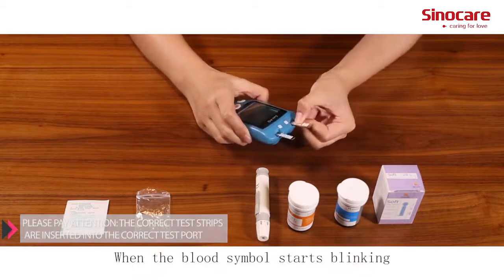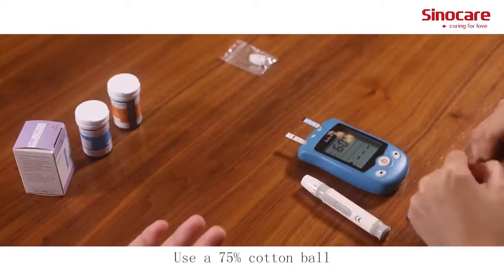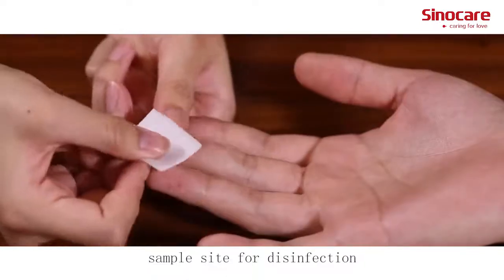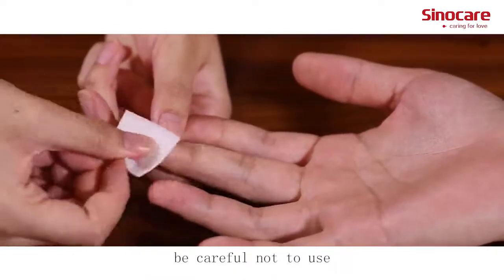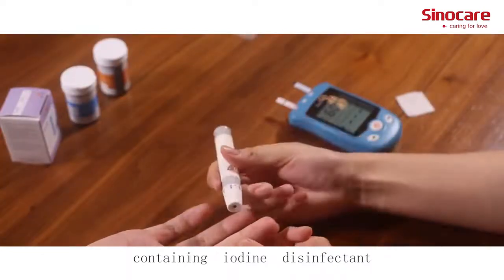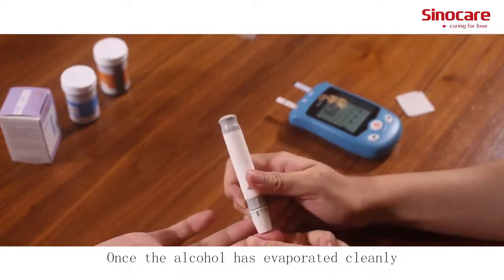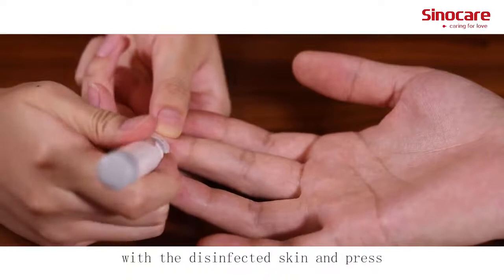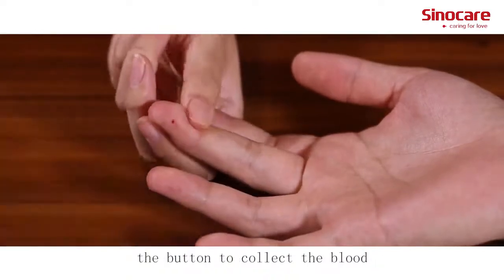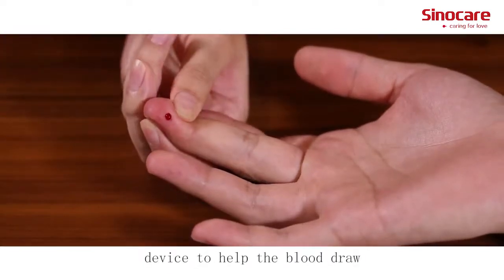When the blood symbol starts blinking, the meter is ready to use. Use a 75% alcohol swab at the blood sample site for disinfection. Be careful not to use iodine or any disinfectant containing iodine. Once the alcohol has evaporated cleanly, align the puncture device with the disinfected skin and press the button to collect blood. Use your thumb to press the lower part of the puncture site to help the blood draw.